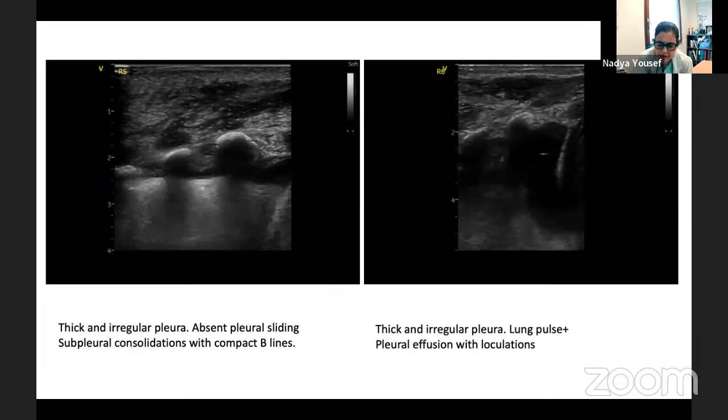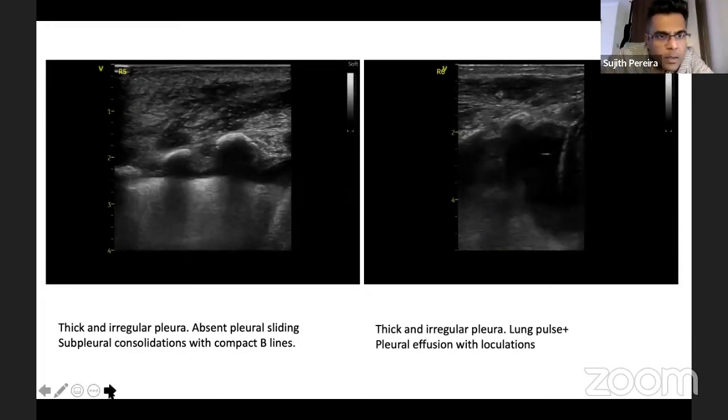In adults, this is one of the uses of lung scoring in adult medicine. It's to see how patients improve or don't improve on antibiotics when they acquire ventilator-associated pneumonia. But this picture is so rich. There's so much more than what you expect for just pneumonia. So I think it would be interesting to see the rest. And could we move on to the left lung, especially the L2?